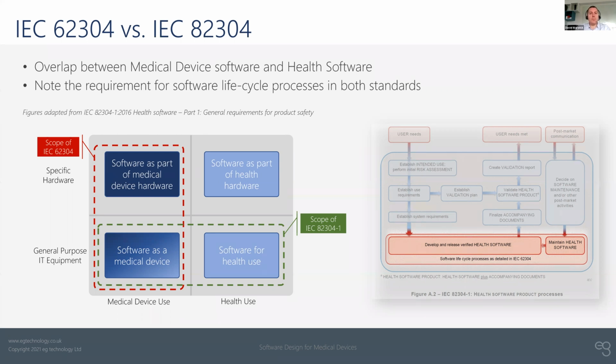But the important message to take from this slide, though, is although the two standards are different, they cover much of the same software life cycle. The fact that you have to initially define your software architecture, go through the requirements for that software, then develop it and then test it. Actually, the processes are very similar.